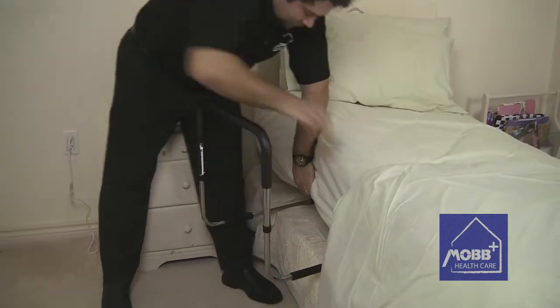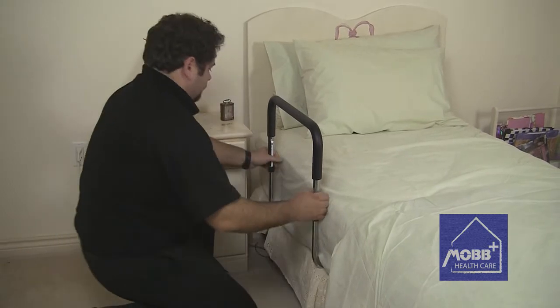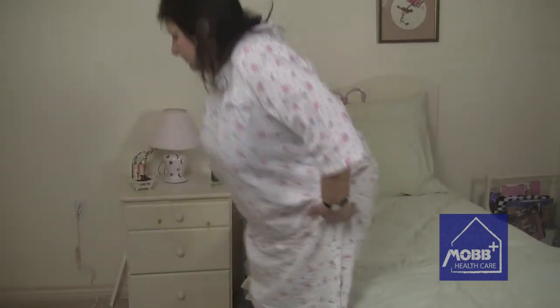No tools are required to assemble the railing, which slides under the mattress and is held in place by non-slip foam on the base bar, as well as safety straps that can be used to securely mount the railing to the bed. The safety straps are long enough to be used on any standard size of bed.